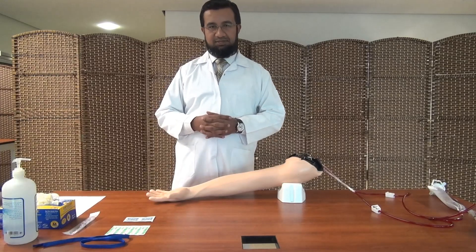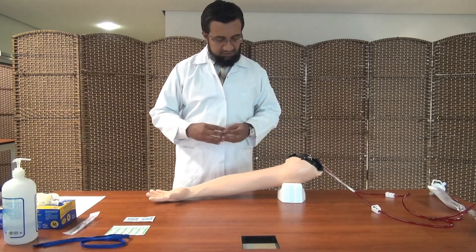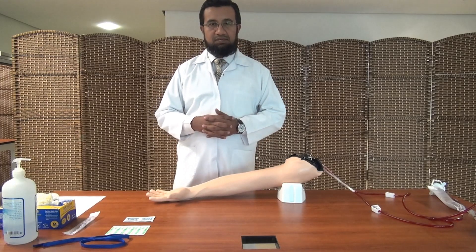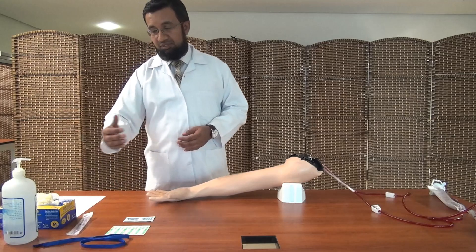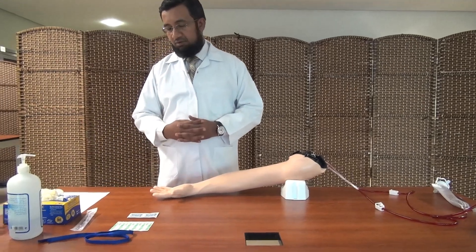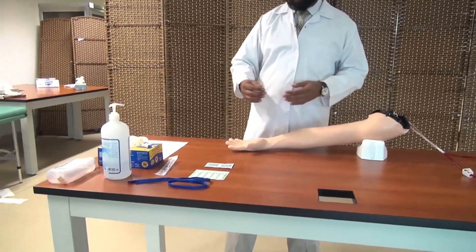Welcome to Al-Faisal Clinical Skills Center. I'm Nasser Ali Afsir and I will demonstrate to you today the technique of intravenous injections. Let me show you what are the required materials you would require for this activity.